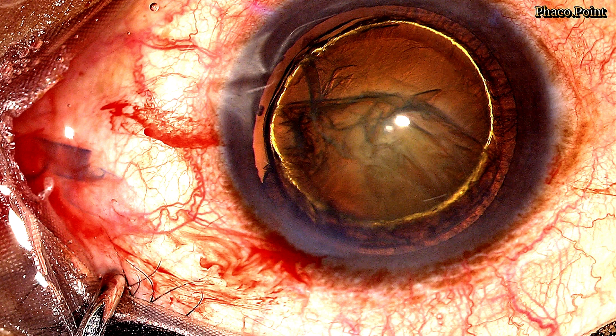Performing a hydrodelineation in a soft polar cataract is a lot simpler, because all you need to do is bury into any part of the nucleus at the depth of your choice and inject some fluid with some force. The resultant endonucleus will depend on that point at which you started to inject the fluid.